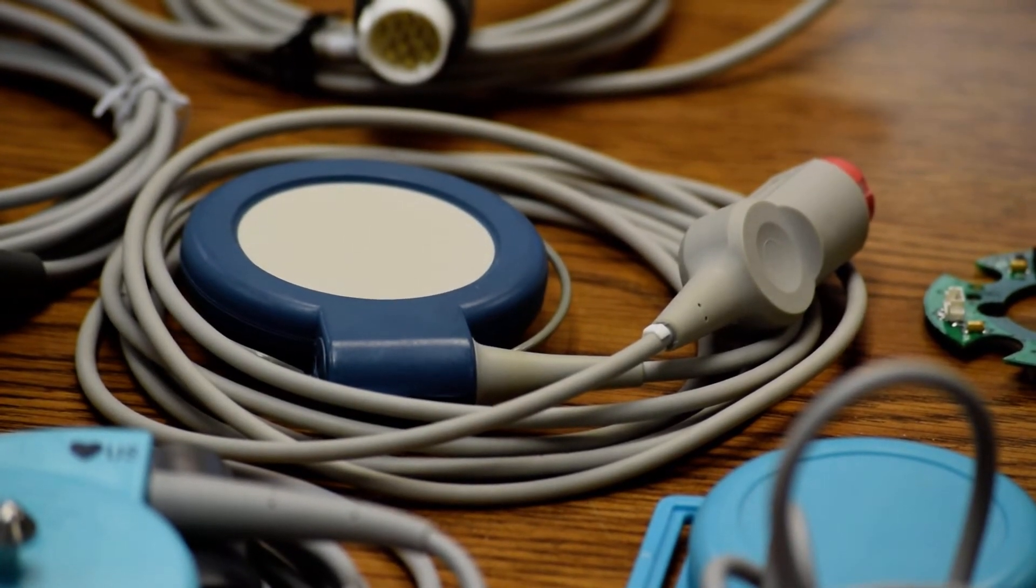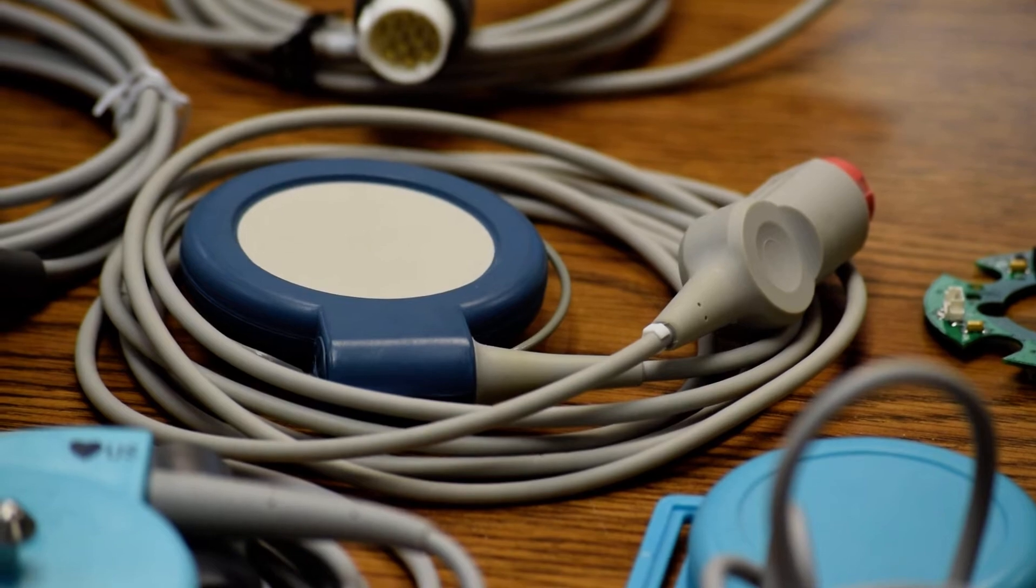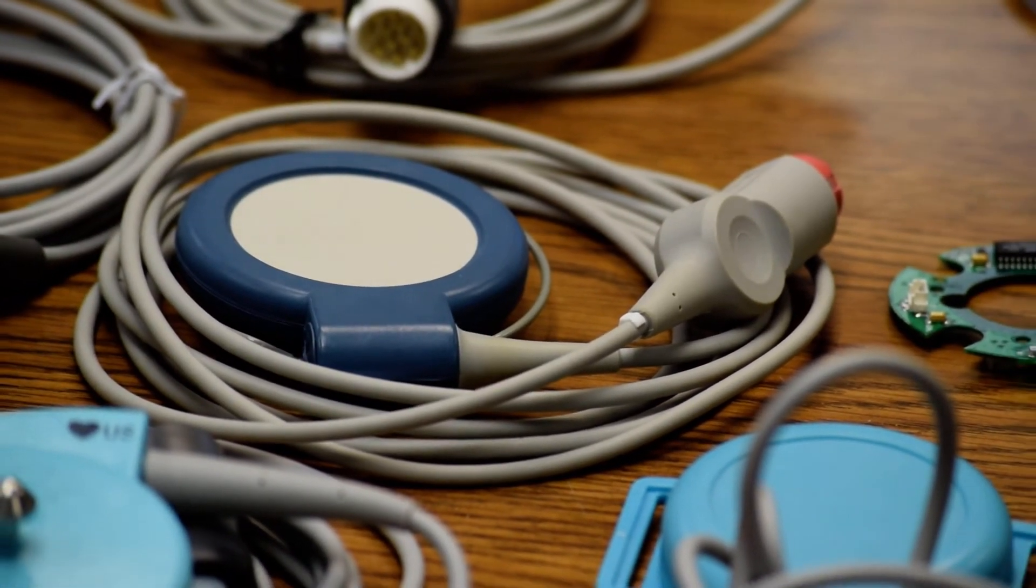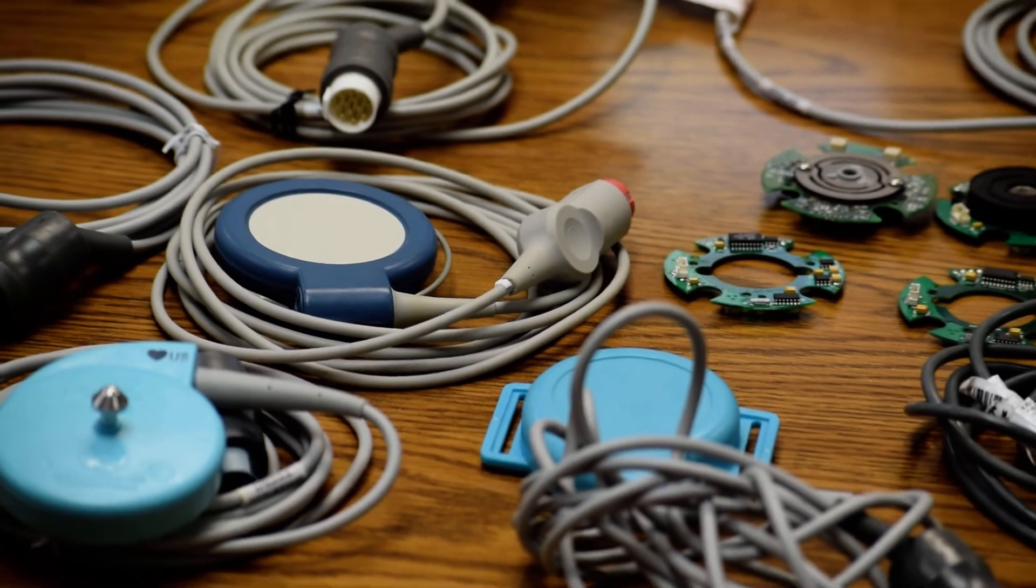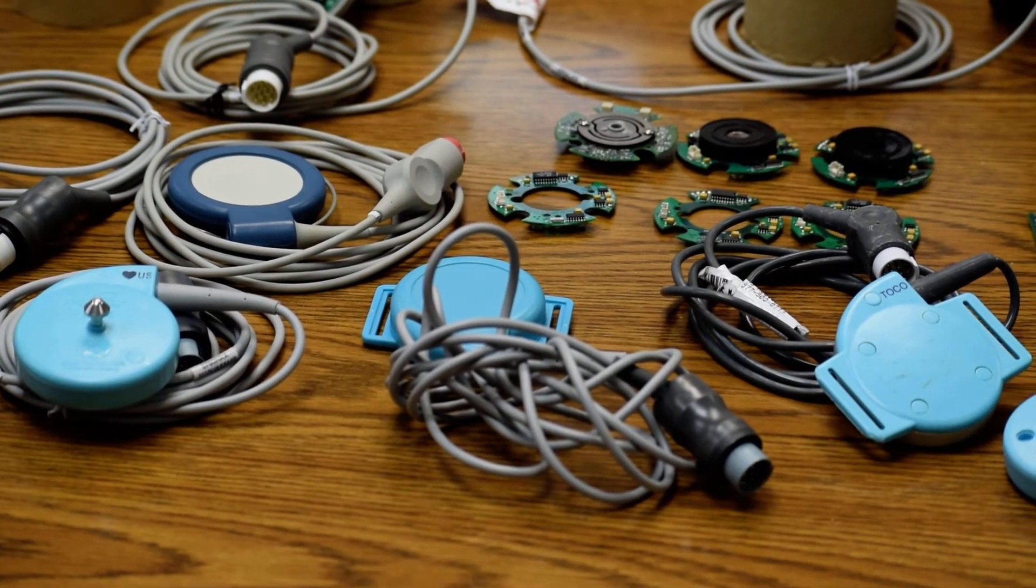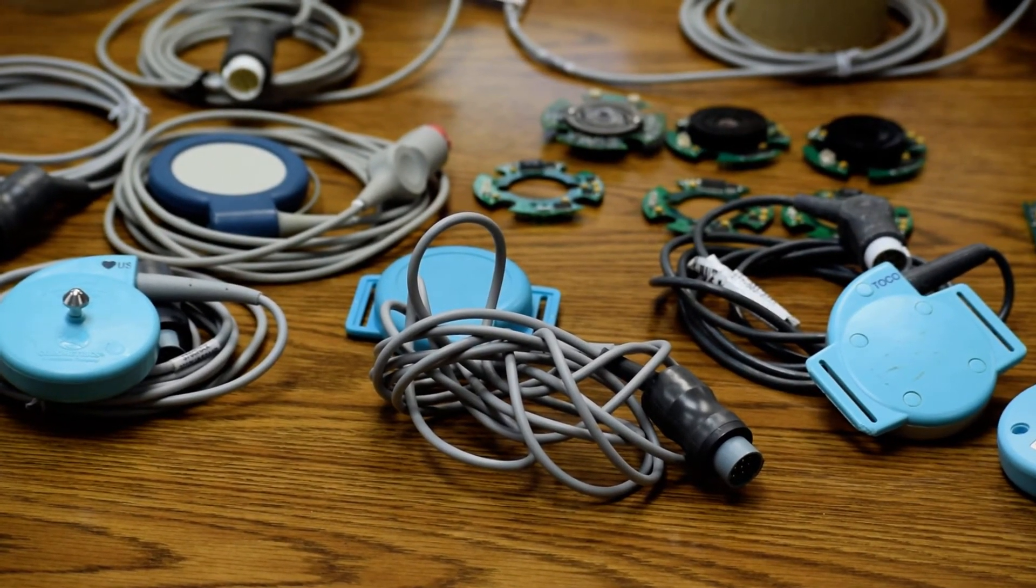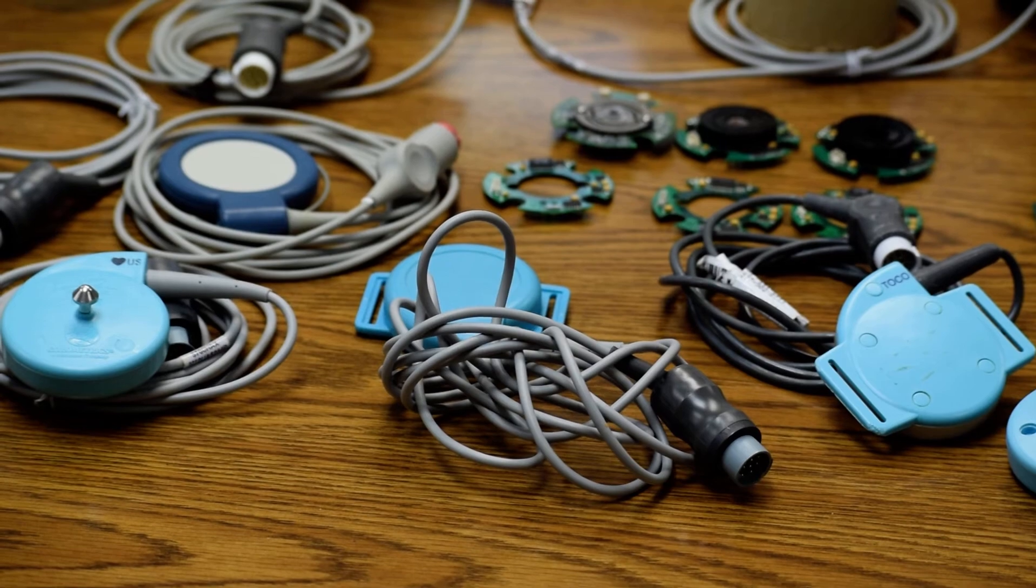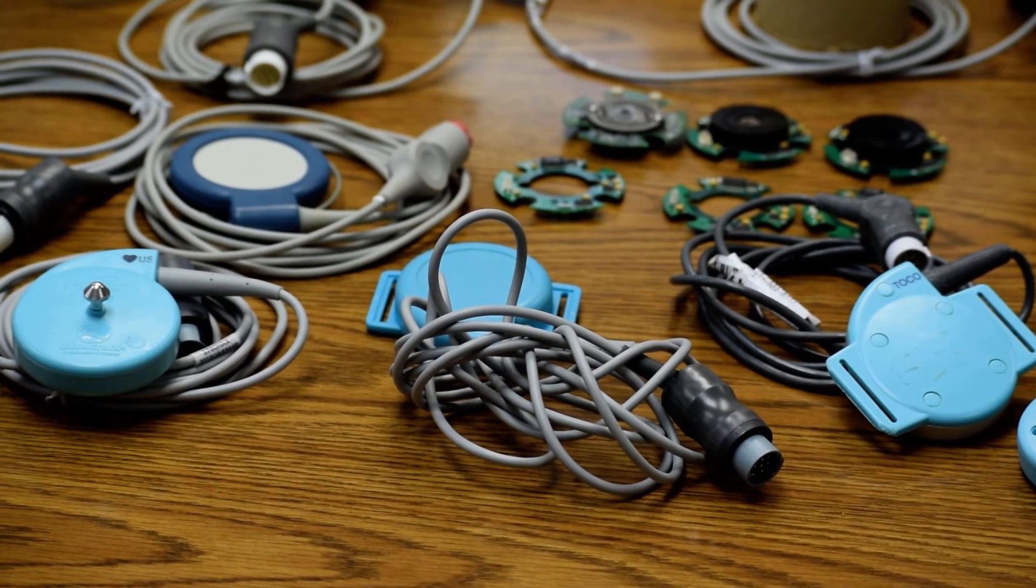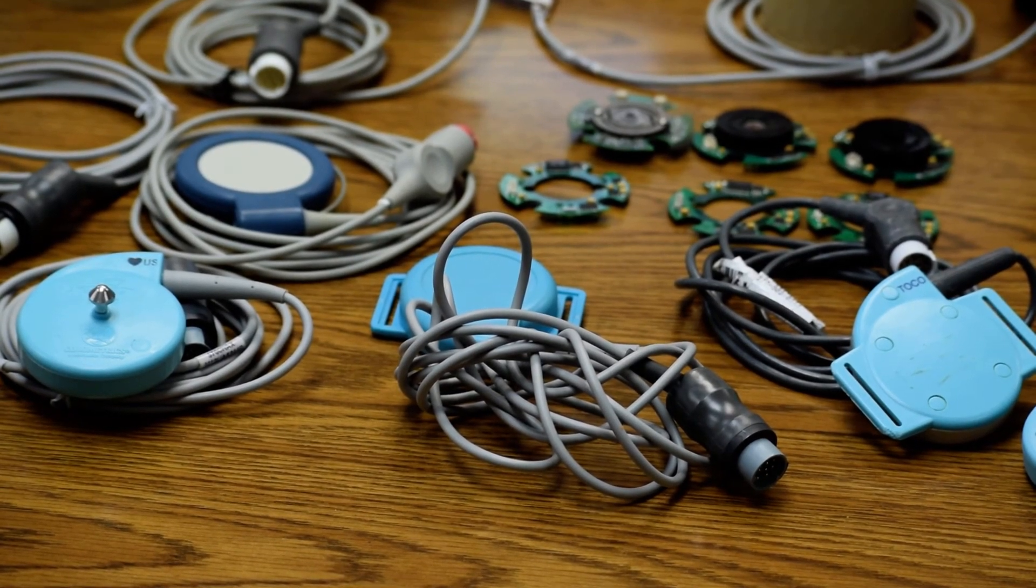We at Iavron repair all these transducers and cables to OEM specifications. Offer 2 year warranty by default on most of the transducers. Extended warranties of 5 and 10 years are available. Offer lifetime warranty on crystal bonding of all ultrasound transducers as we developed innovative proprietary QR cube technology.